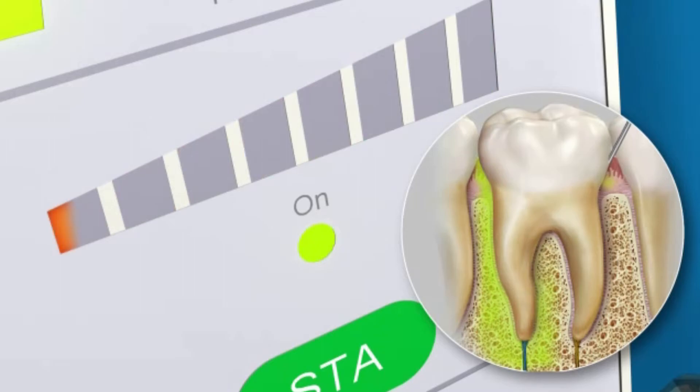Visual and audible real-time feedback is provided by the pressure sensing technology, allowing the system to precisely control the pressure, flow rate, and volume being dispensed.